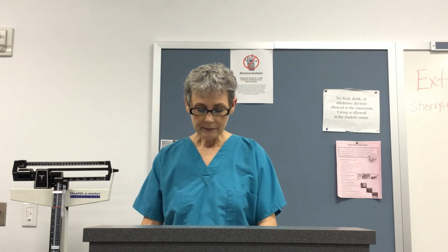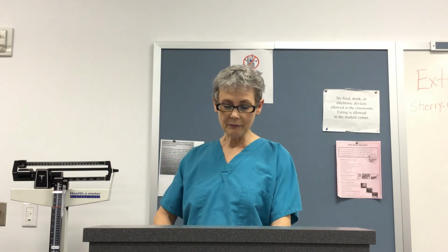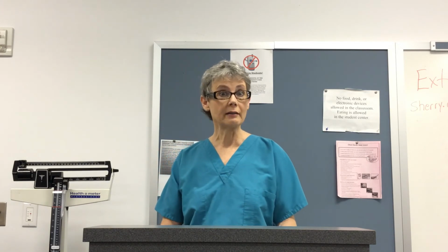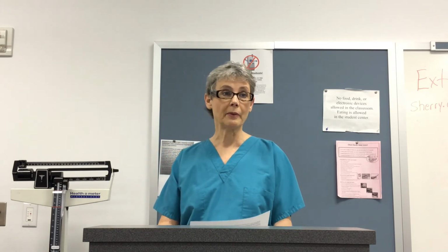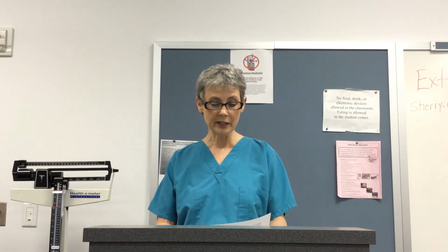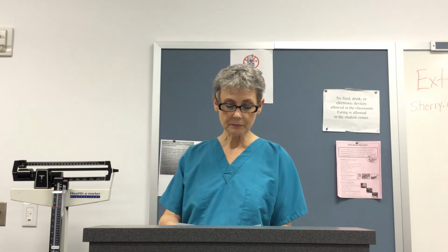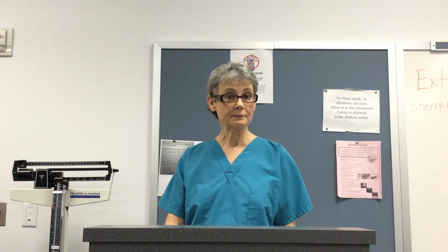Okay. Let me remind you also that when you are giving an IV med, you still check your rights. You check for allergies, and you check the patient's labs and their medical history, for all those things that I have mentioned earlier. And I believe I said on one of the videos that some of the newer injection ports will not allow you to aspirate.